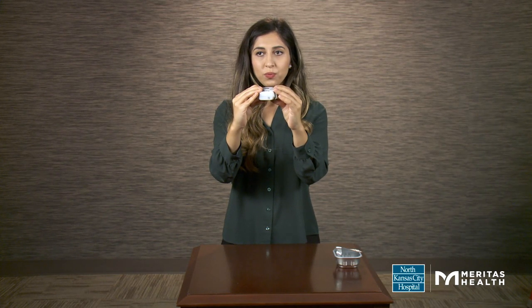Remove the inhaler from your mouth. Hold your breath for as long as you can, up to 5 seconds. Open your mouth and breathe out slowly.